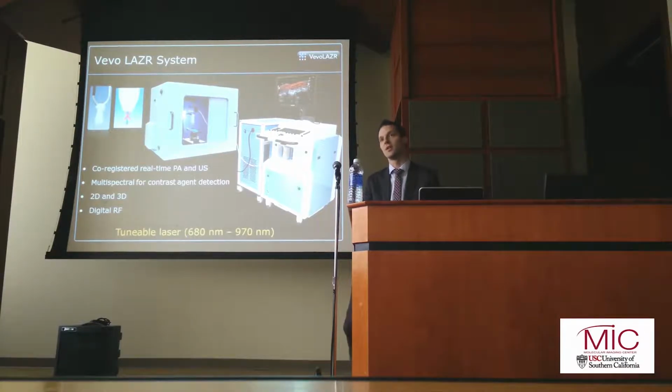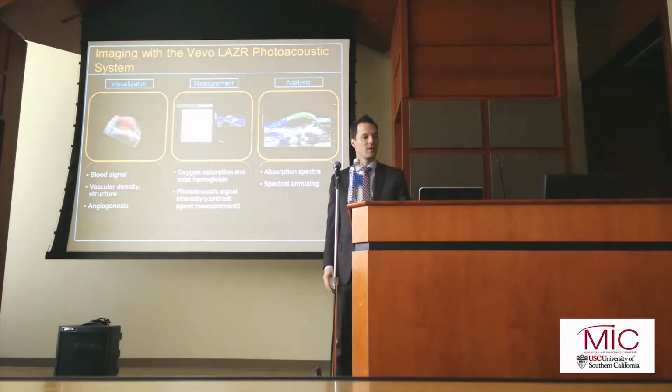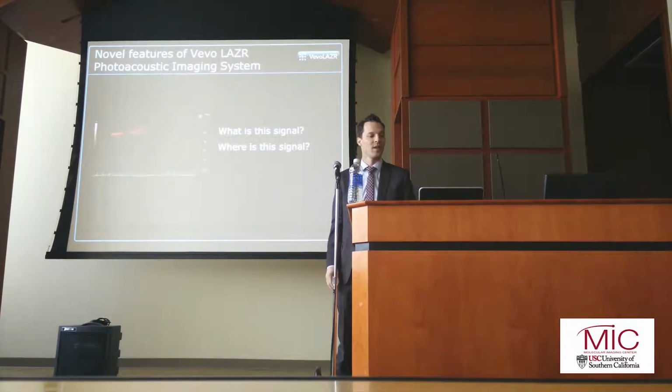The key feature of the whole system is the ability to tune the laser, and I'm going to talk about that in quite a bit of detail later. But this allows us to do things like multispectral imaging. So again, visualization, measurement, and analysis. What can we see? What can we measure? What can we analyze on the system?